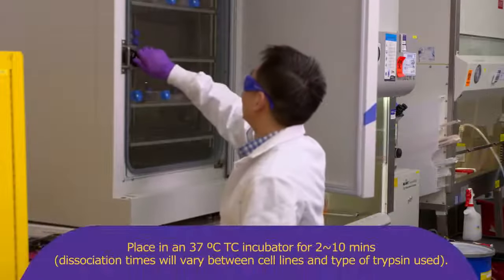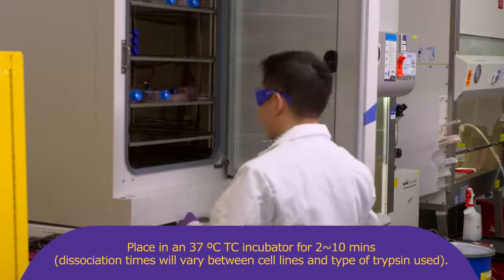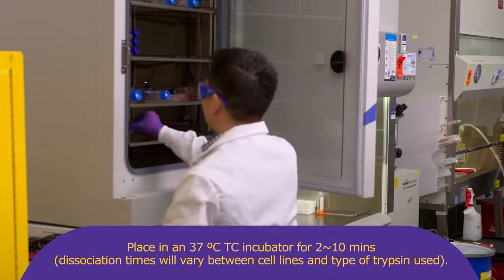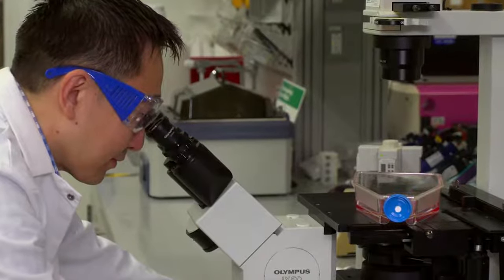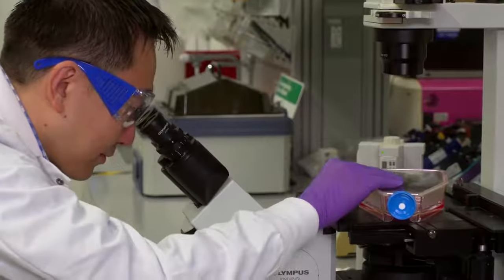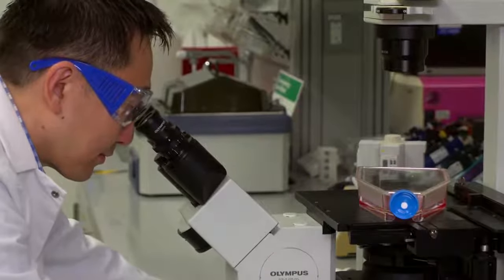Place in 37 degrees Celsius tissue culture incubator for 2 to 10 minutes. Check flask frequently under the microscope to ensure that greater than 90 percent of the cells have dissociated from flask surface.